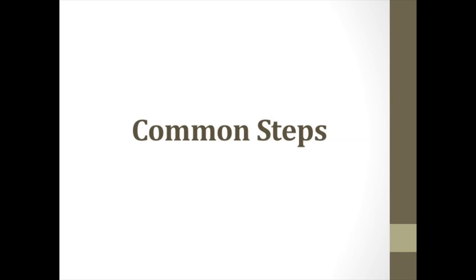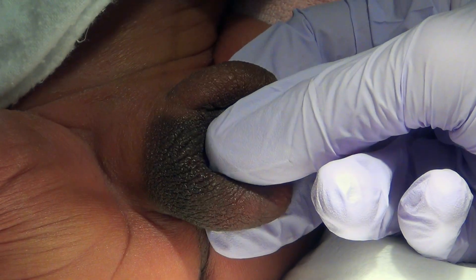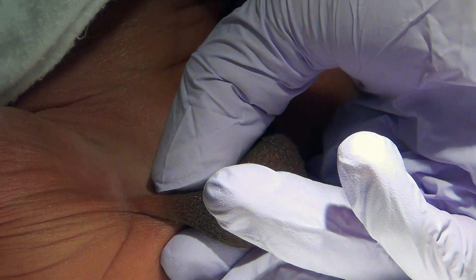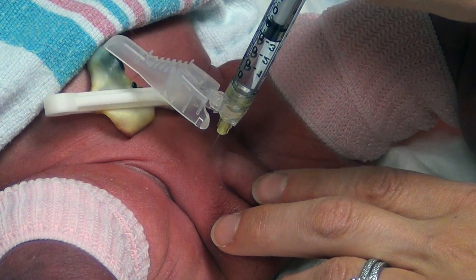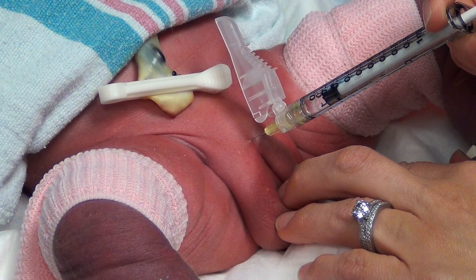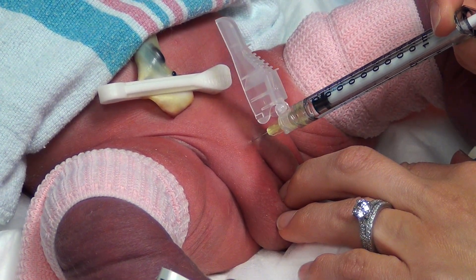The first steps of the procedure are common to use of both the Mogan and Gomco clamps. The neonatal genitalia is briefly inspected for an absence of hypospadias and bilaterally descended testes. An antiseptic swab is then used to cleanse the skin at the base of the penis. Installation of 1% lidocaine without epinephrine is used to perform a dorsal nerve block at the 10 o'clock and 2 o'clock positions at the base of the penis.